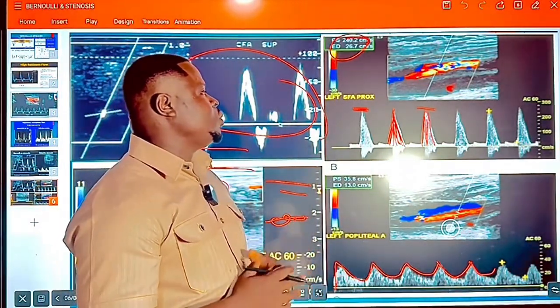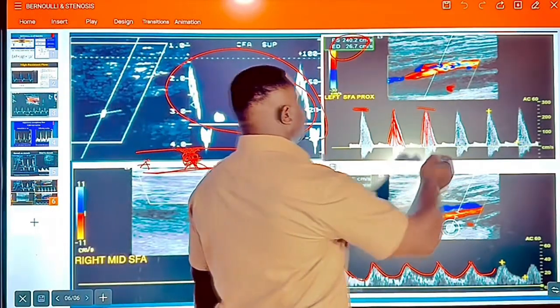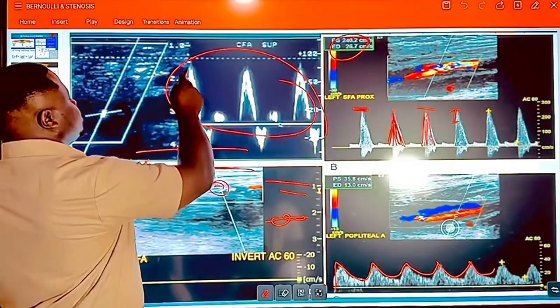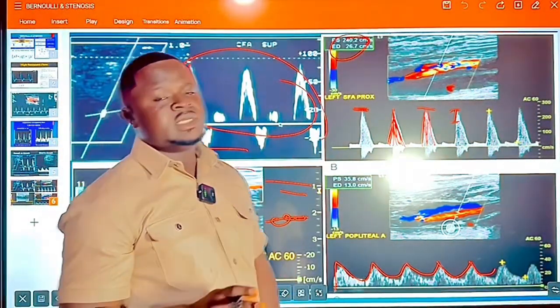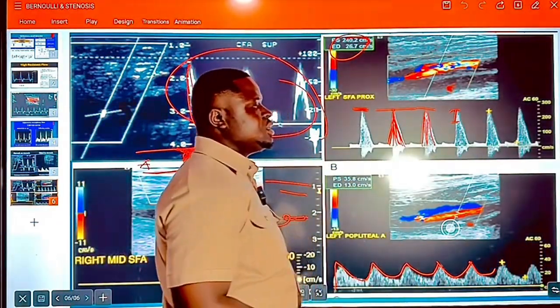So when doing lower extremity arterial Doppler ultrasound, factor in the velocities, know the normal waveform here, and mind you that at the point of stenosis, the intrastenotic point, the velocity is going to increase substantially.